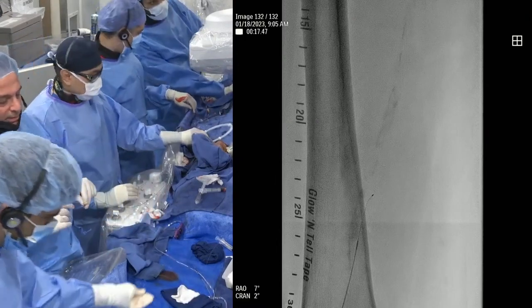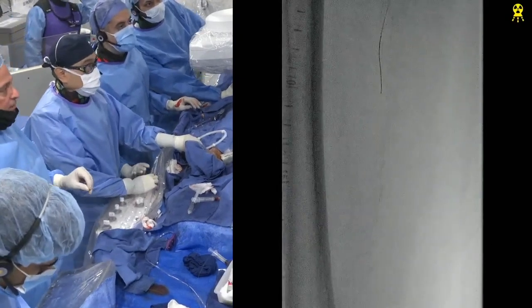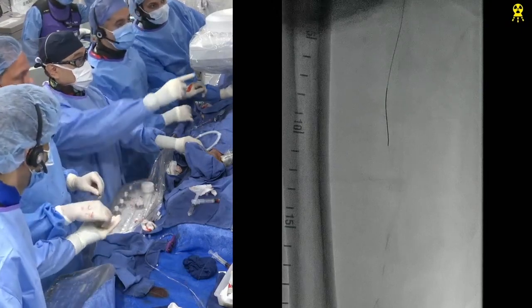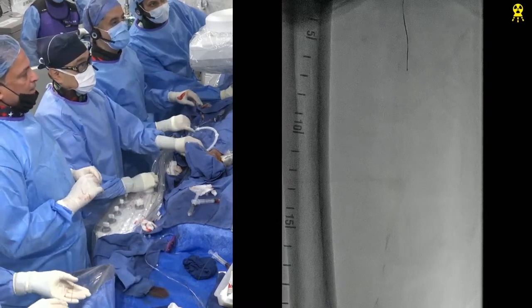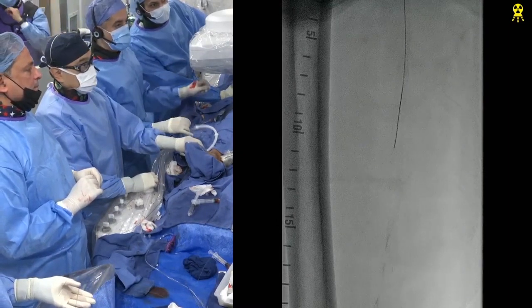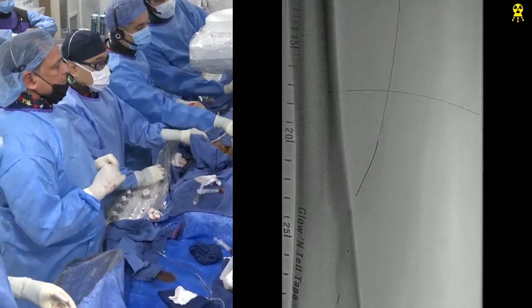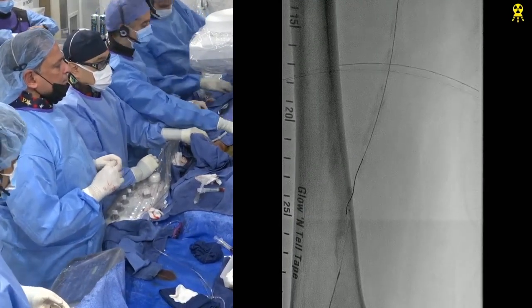Pull mine back, Ray. The camera back. Let's go up a little bit, Ray, for a second. Yeah, you guys go up. You're on a little collateral. I may need a torquer on this. Yeah, I'll give you a torquer. Yeah, come back. There you go. Can I get a torquer? Yeah, sure. Beautiful. Another collateral. There you go. Perfect. Nice. Watch for the ultrasound. Take the ultrasound. Don't drop it. Okay, perfect.